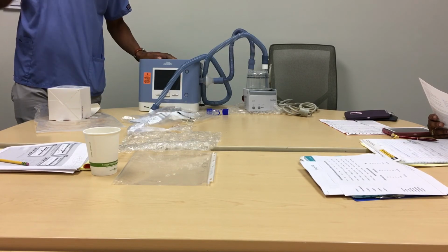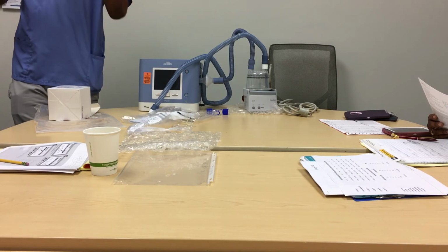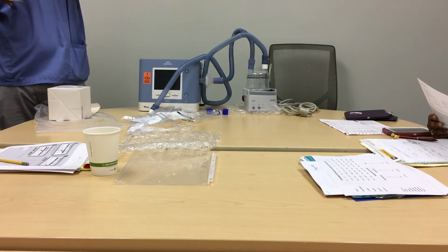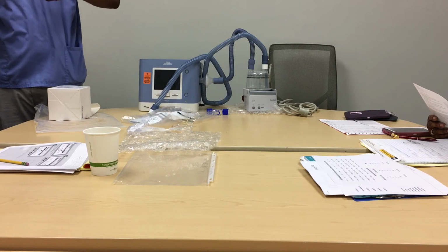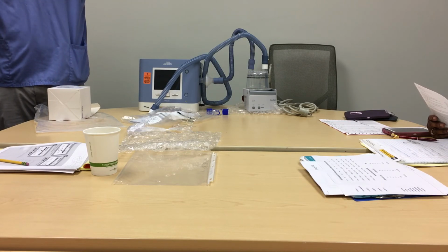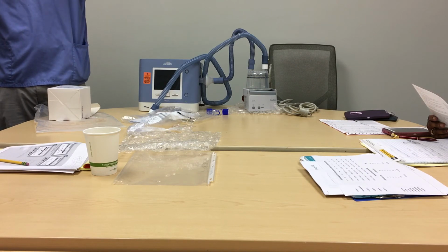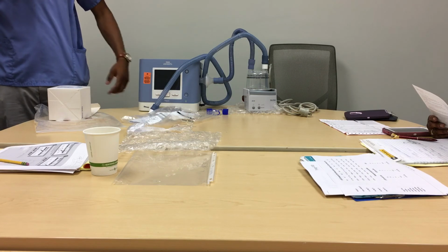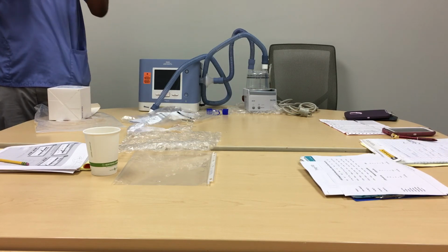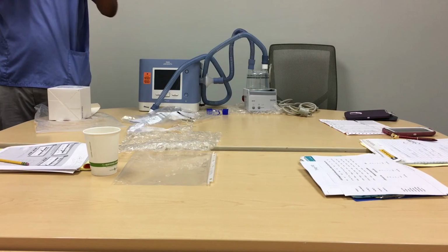Kind of, because in fact the oxygen interface is almost like a venturi. So as you inhale, it helps let air in, which augments your volume. Due to that volume augmentation, they will need less oxygen per se. But now it doesn't have a motor. It uses the oxygen supply to drive it. Exactly.